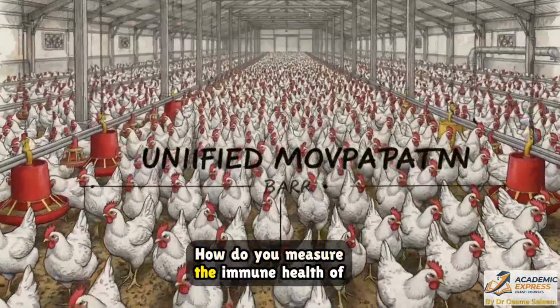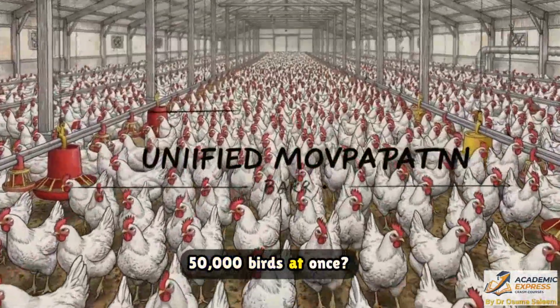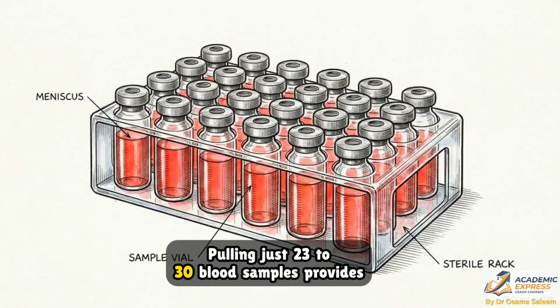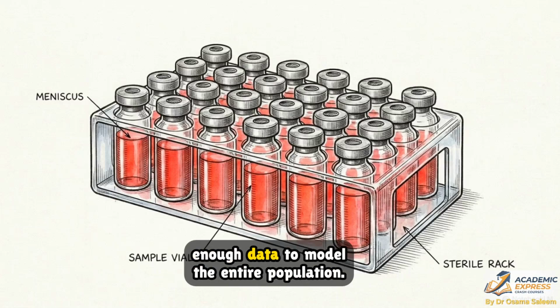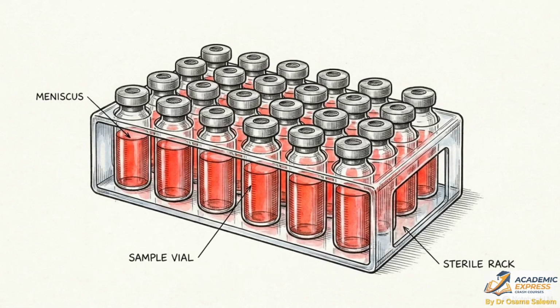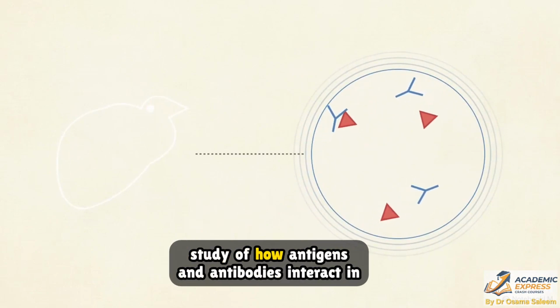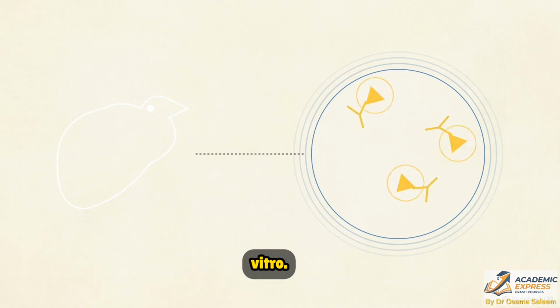How do you measure the immune health of 50,000 birds at once? You don't test them all. Pulling just 23 to 30 blood samples provides enough data to model the entire population. This is the foundation of avian serology, the study of how antigens and antibodies interact in vitro.